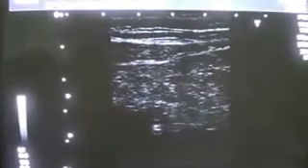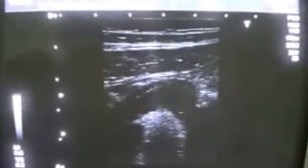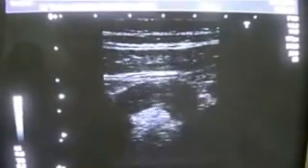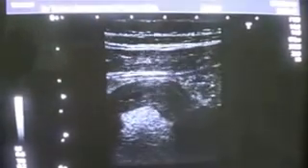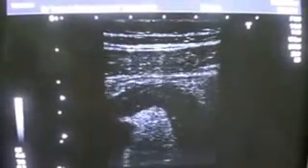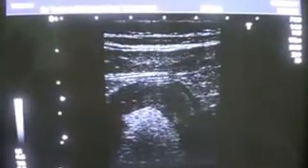I am in the region of the right iliac fossa of a young male, and from this area we see a tubular structure with no movements, and wall layers are seen.